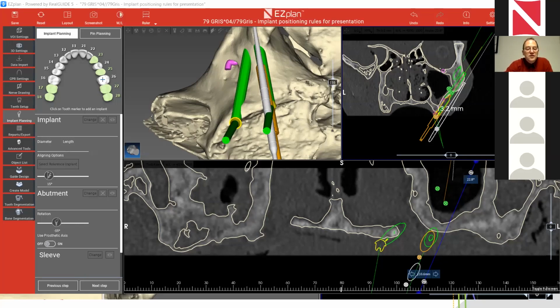The question is, I only ever use the rough diamond. When would you ever use the medium or smooth groove burr? Well, when we started, we decided to make 3 courses of diamond: the coarse, the medium, and the fine. Usually, we use only the coarse. Even if we perforate the maxillary sinus wall and we approach the membrane, it wouldn't really damage the membrane.